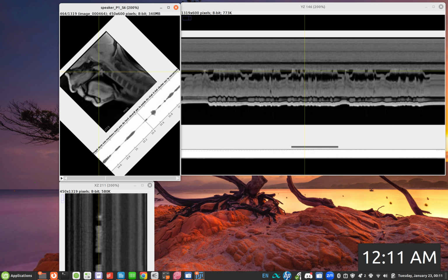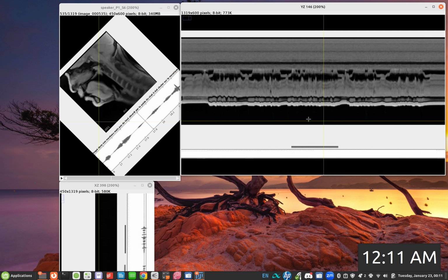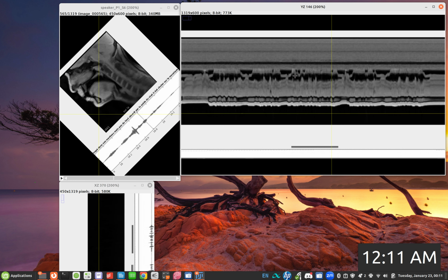We are only trying to make sure that the vertical lines are at a place which captures the line of velum's vertical movement. Now, going back to the YZ kymograph, this is the kymograph we are interested in. Now that we have found the vertical line that we want, and the placement is good, we are confident that this is the kymograph that we want. Now, to give you a little information about what this kymograph means and what to look for.